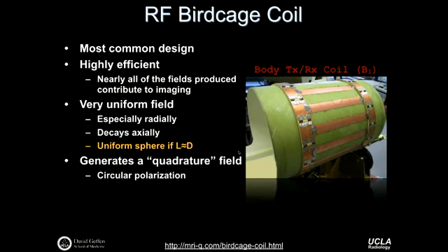And I'll show you in just a couple slides how this is actually used to generate what's called a quadrature field, or to me, a little more logically, to generate those so-called circularly polarized fields.